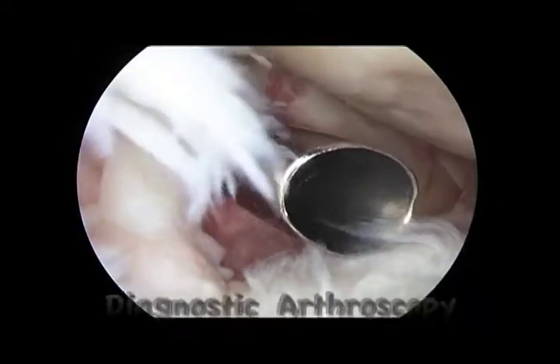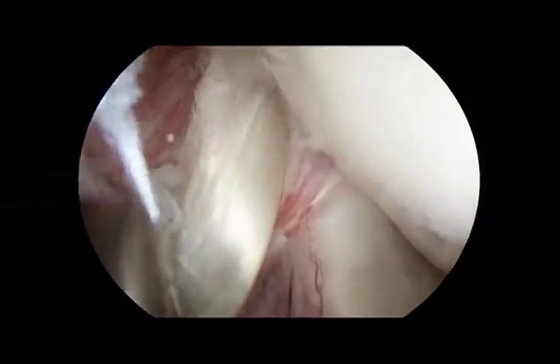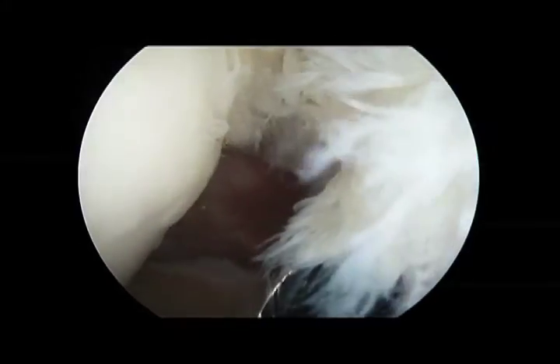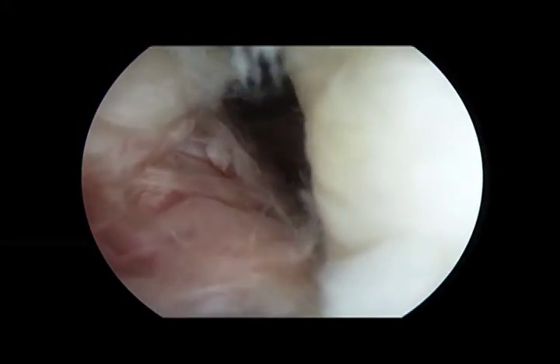At arthroscopy, we begin with a standard 15-point diagnostic evaluation of the glenohumeral joint. Viewing from the posterior portal, we note the large delaminated tear involving the supraspinatus tendon with minimal retraction and an intact infraspinatus. When viewing from the anterior portal, we were able to better appreciate the full-thickness nature of the tear.